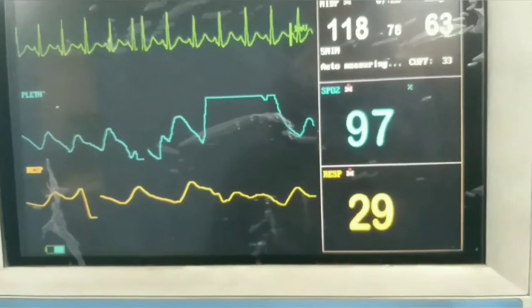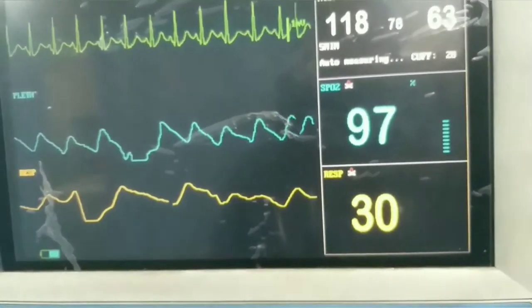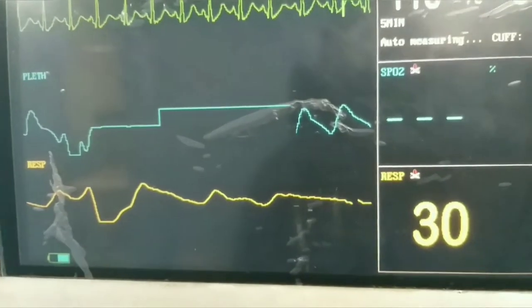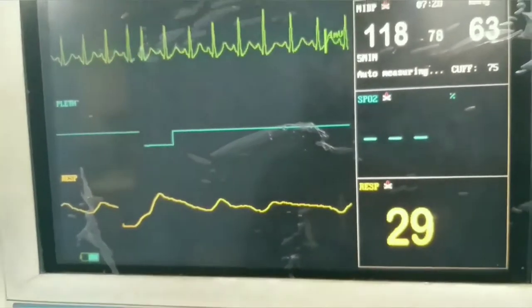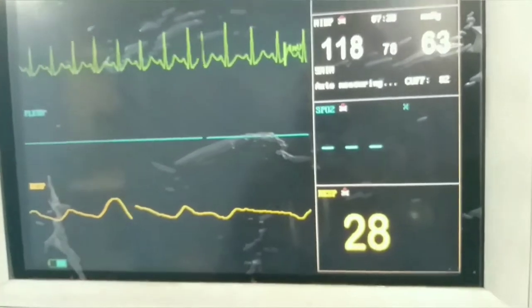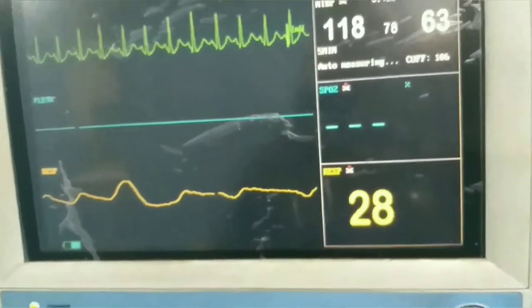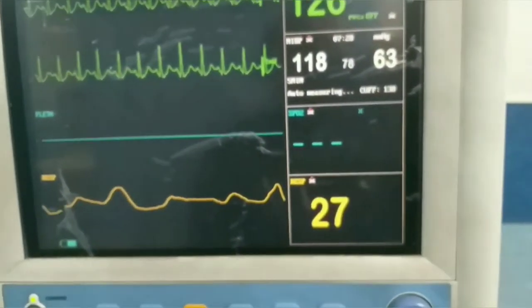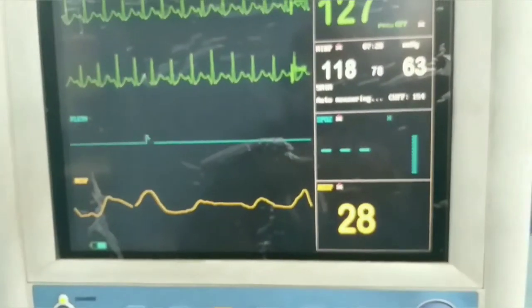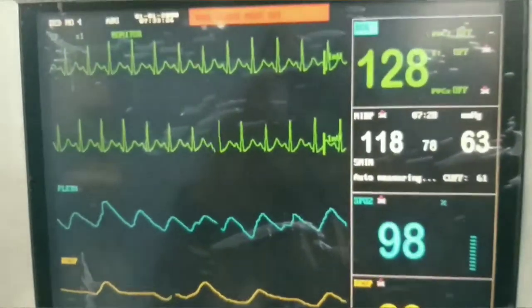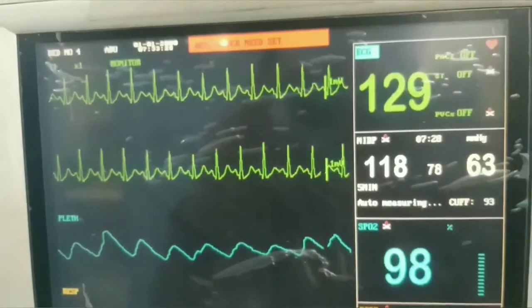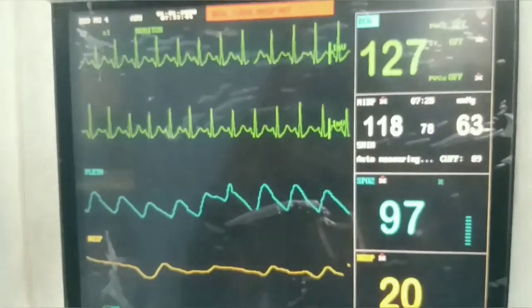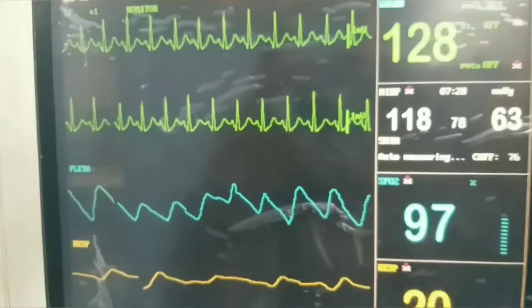97 is the saturation, measured with the help of the SpO2 probe. When we take the probe off the finger, there will be no waveforms displayed. The respiratory rate is 28. When we put it back, there is a nice smooth waveform and 98% SpO2 is displayed.